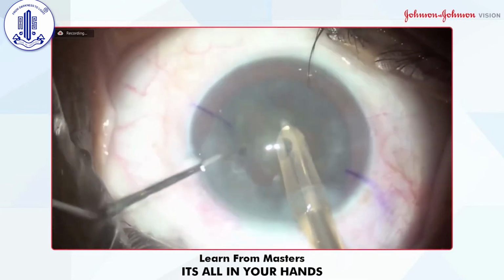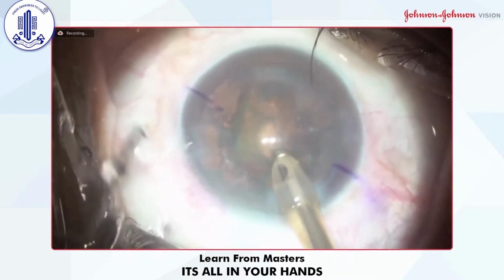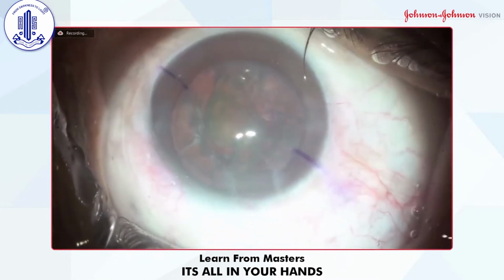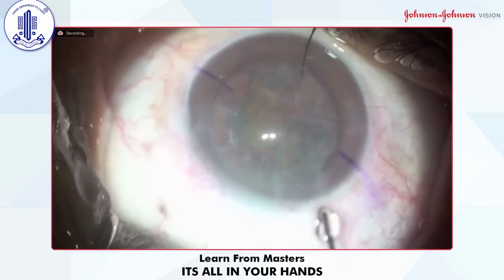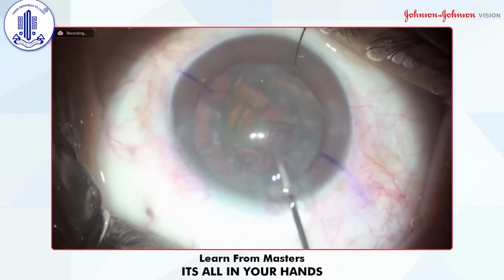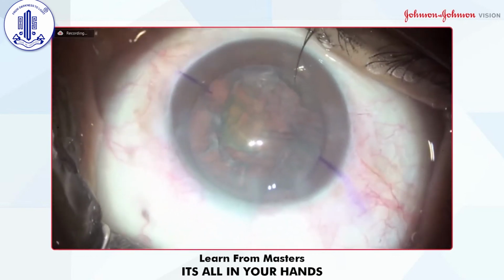So we're reducing the vacuum. So using more and more Helon because the endothelial count is less. So you saw that I cracked the nucleus.